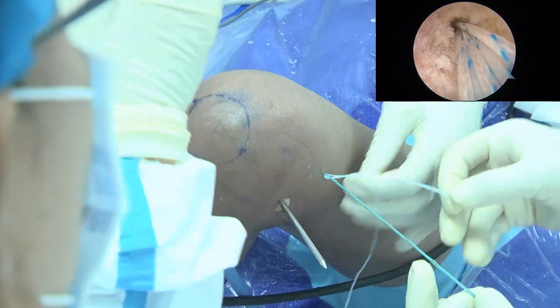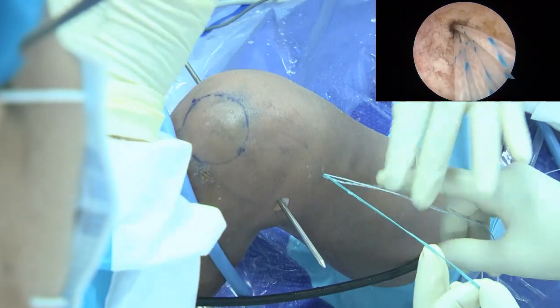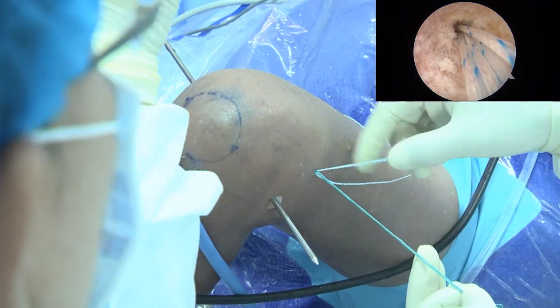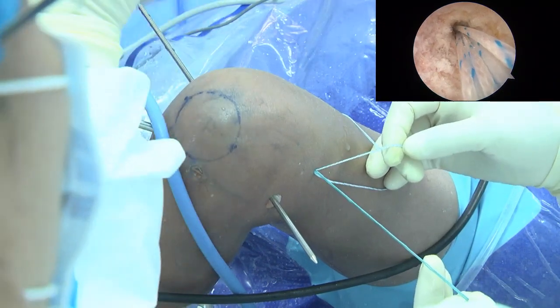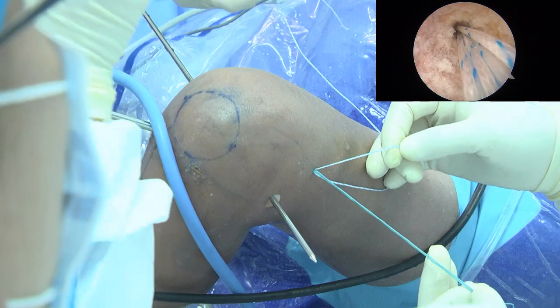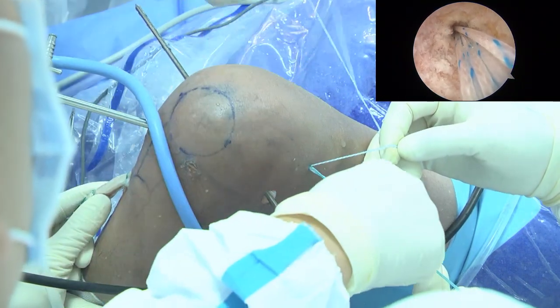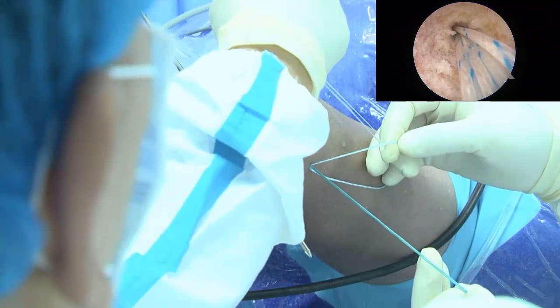Because in the past we pull the button very strong, and then we get into the soft tissues. Sometimes you go out to the IT band and you cannot pull it back. From X-ray look ugly, right? So this way you make sure that your button is sitting on the cortex. That is a safe way, okay? And look at the hand, right? So don't need this. Yeah, this one not yet.